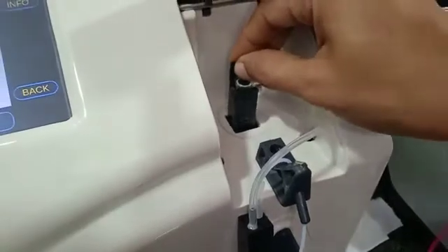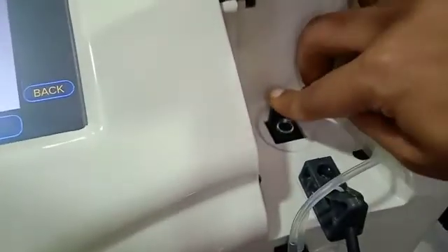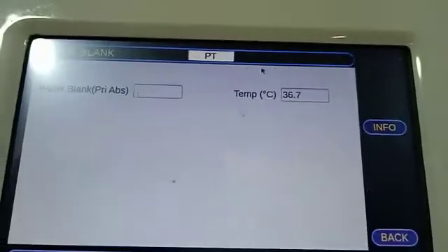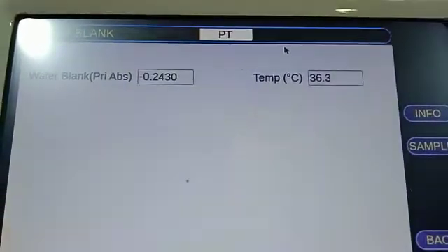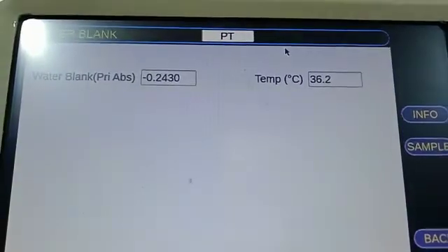Now we are doing the water blanking. We are adding the water in the tube and press the aspirate button.